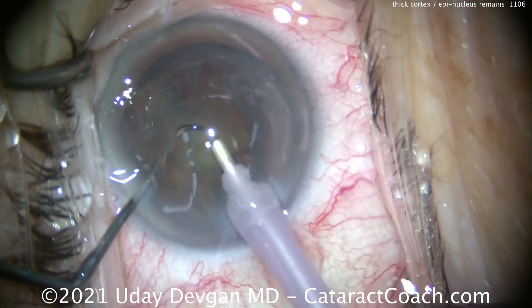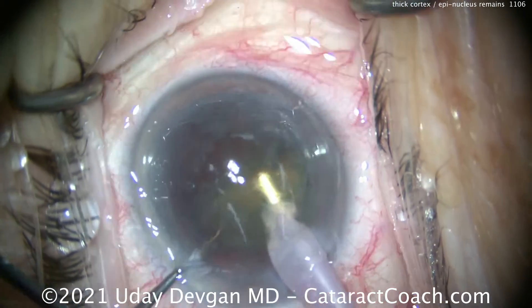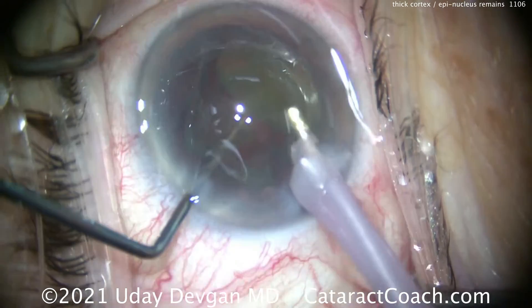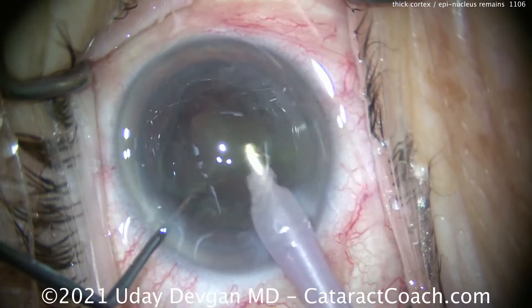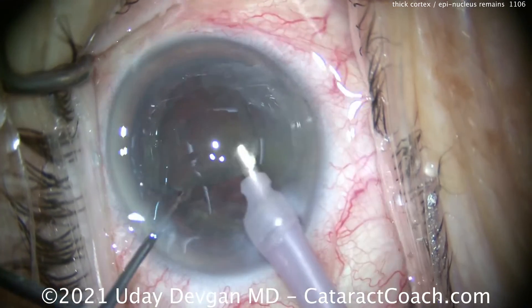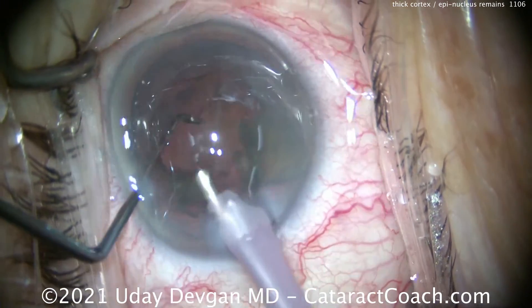We're leaving behind an epinuclear shell and some thick cortex. And again, the reason behind this is we didn't have the best hydrodissection. We saw the golden ring and had good hydrodelineation, which is separation of the epinuclear shell from the endonucleus. But we didn't have good hydrodissection, which is separating the lens cortex from the capsule.